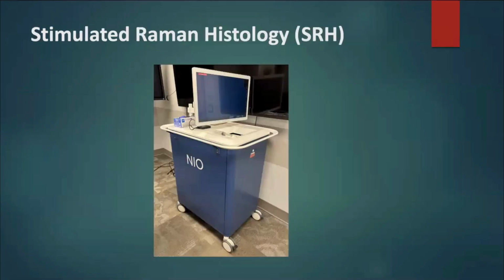Now, that leads on nicely to my last topic for discussion. So stimulated Raman histology is one of Dr. Manis's research interests, and I'm sure people will have seen this machine rolling around the office. So stimulated Raman histology is a novel real-time imaging technique that provides histological images of fresh, unprocessed and unstained tissue within minutes. These images are displayed on a screen and can be interpreted either by humans or AI.